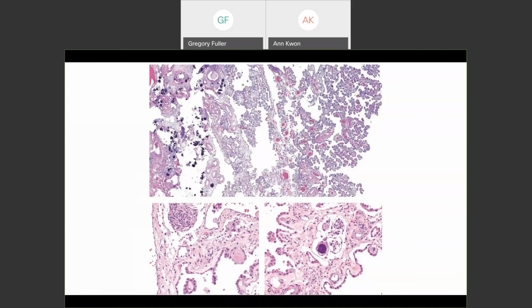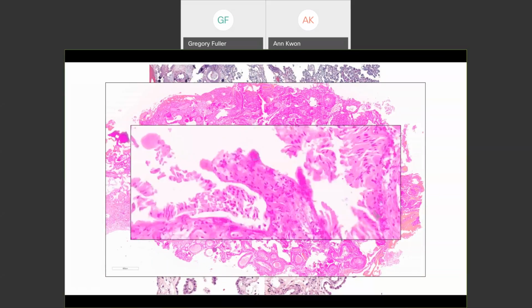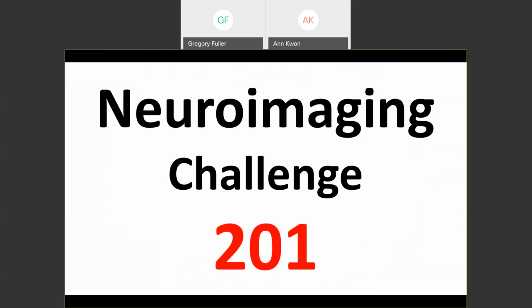But you know what? This is nice to see this beautiful histology, but really Histology for Pathologists, this is not what we should be putting in these chapters of the book. You know what we should be putting? This is what it needs to be, because this is the normal histology for pathologists. And this is what choroid plexus epithelium looks like, all right, when you take the cautery to it. How do you like that? That's just a little observation. Okay, that was fun. Histology.